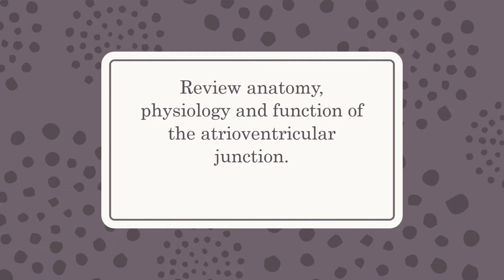We're going to be covering junctional rhythms and SVT rhythms in our EKG lecture today. The first thing we're going to talk about is the actual anatomy, physiology, and the function of the AV junction.